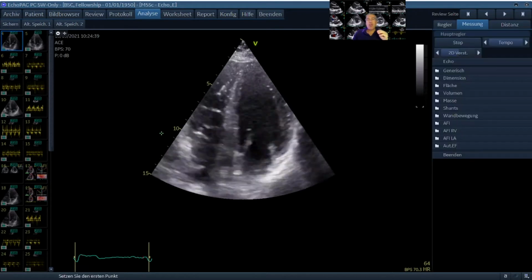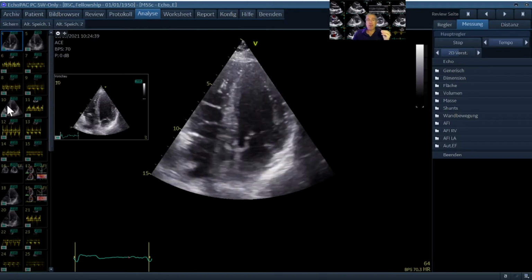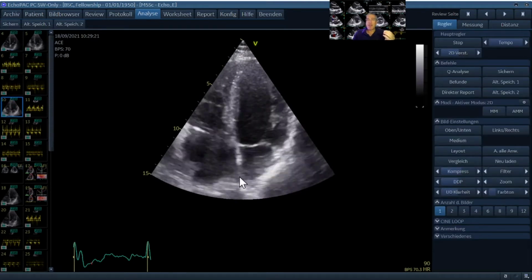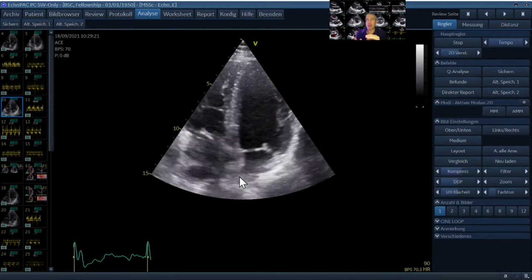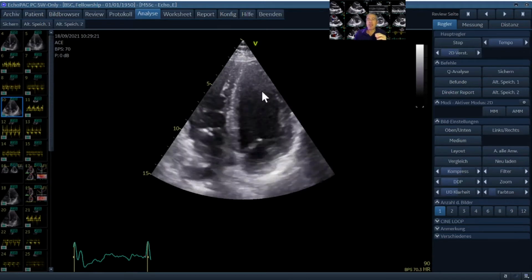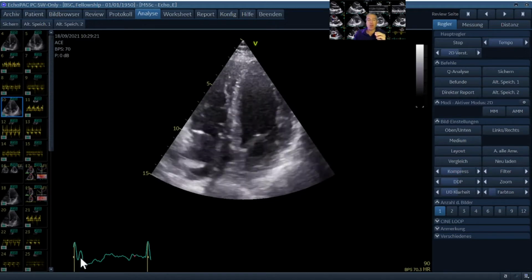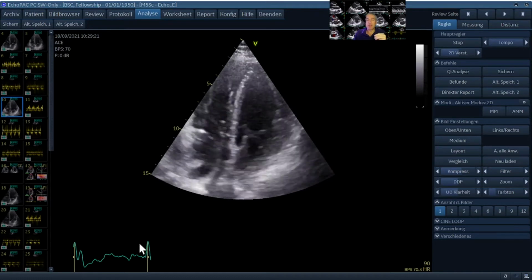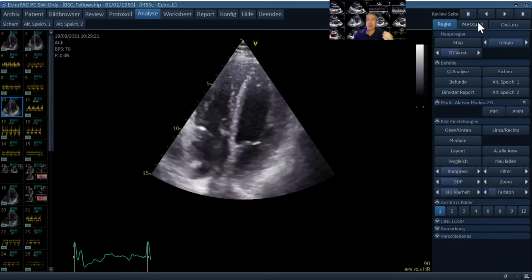Let's now turn the pacemaker off. When we turn it off, we just inhibit the pacing. You see immediately that there is some rocking, just turning on and turning off, and that's an immediate effect. So there is some rocking here, and obviously the ECG looks broader. If you would have a look at the 12-lead ECG, he would go back to left bundle branch block. Let's have a look at the analysis here.